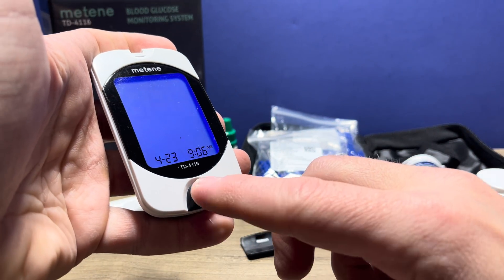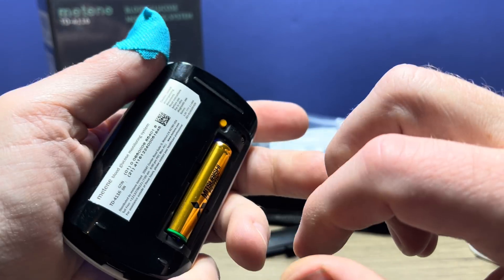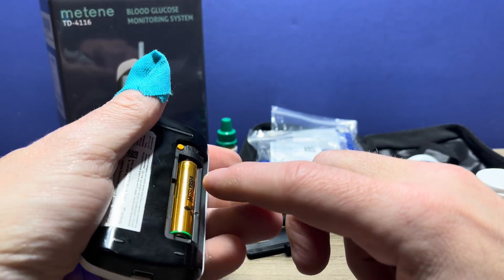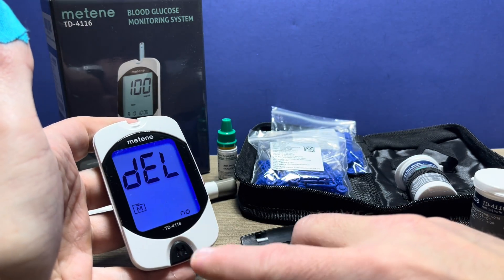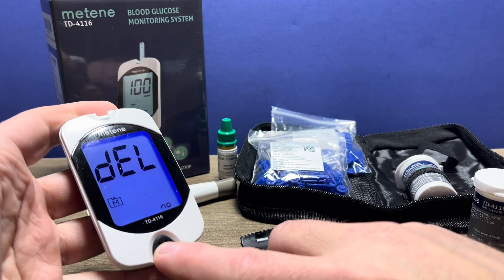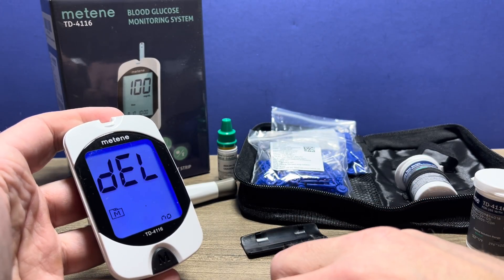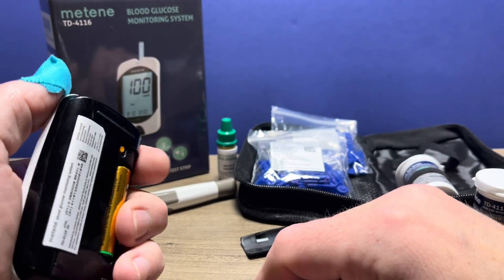Now we're on to the hour. Again, use the M button to adjust the hour, then the set button to go on to the minutes. And once the minutes are where you want them, press the set button. Then this option is to delete the meter memory. If you have it set to yes and press the set button it will delete all your readings. If you leave it set to no it will keep your readings in memory. Press that set button again.